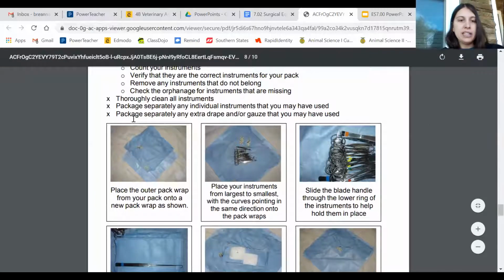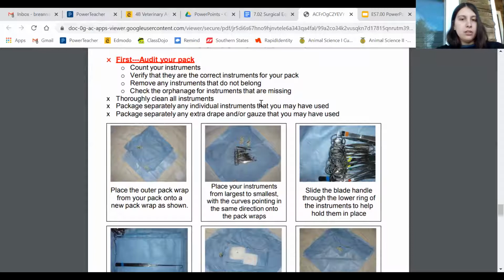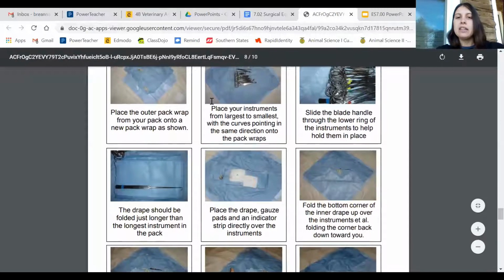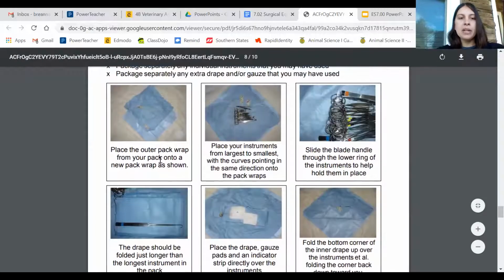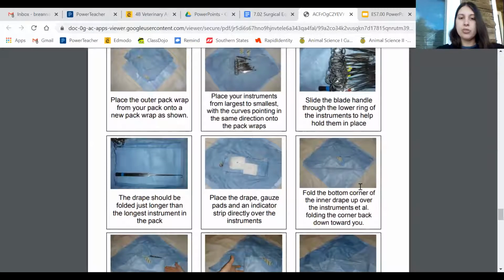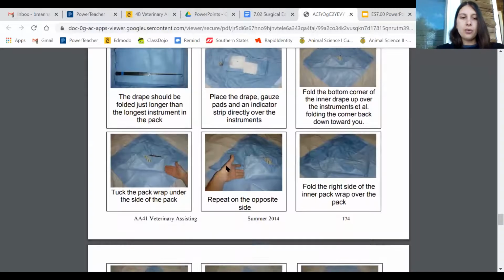Make sure everything is clean. Package anything separately that might need to be packaged separately. Put everything up there. I really like this guide. It seems a little bit overwhelming, but it's really helpful because of all the pictures that it has. Takes you through the steps, how to go through and wrap it.